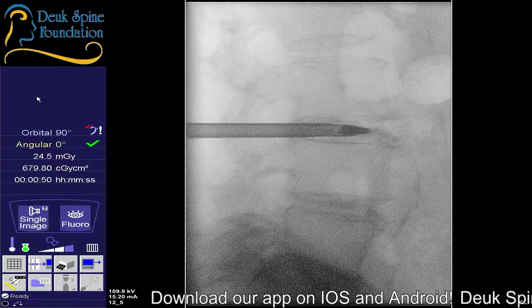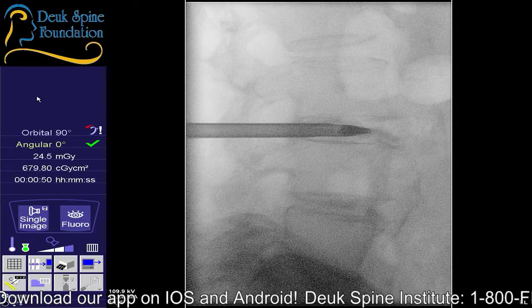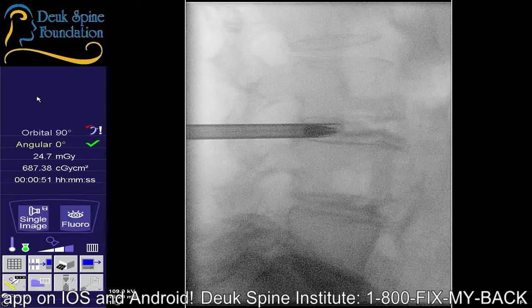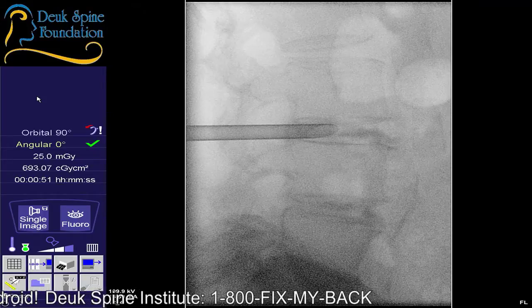Doctor, just to give you a heads up. I'm sorry? Oh, Patel, yeah. Yeah, let Patel know we need him here in 10 minutes. All right, so that's looking pretty good there. And let's get the fluoro out, please.